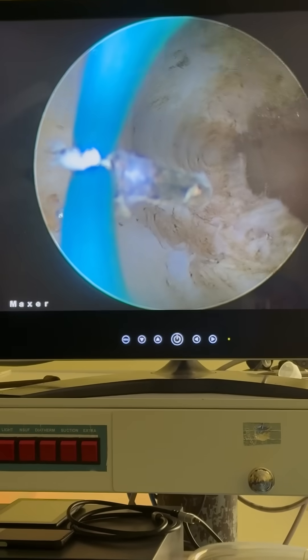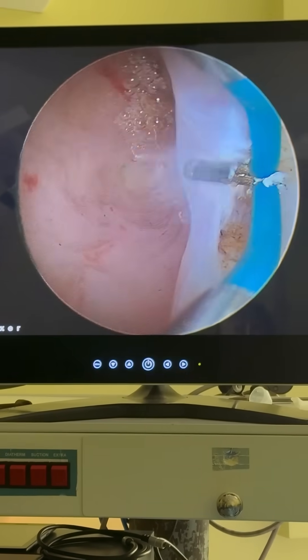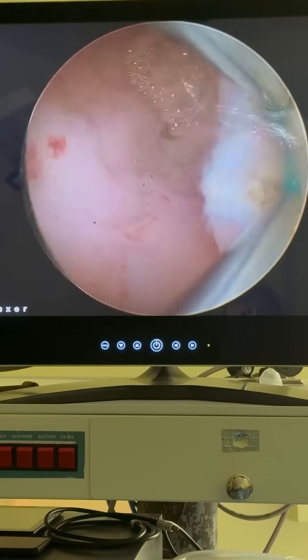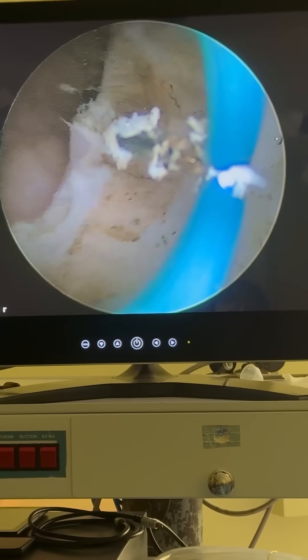Also an important point to note: we should make sure the input and output of the distension agent is monitored, and there shouldn't be any air bubbles when we are trying to do this.